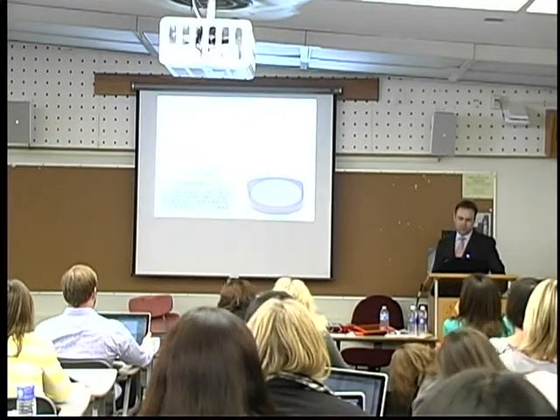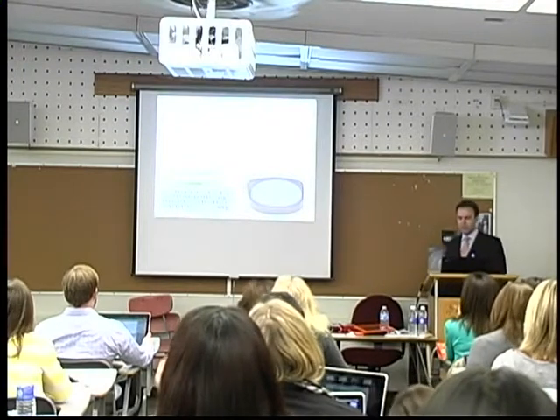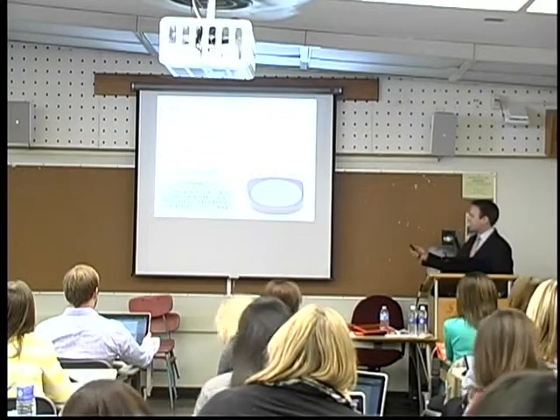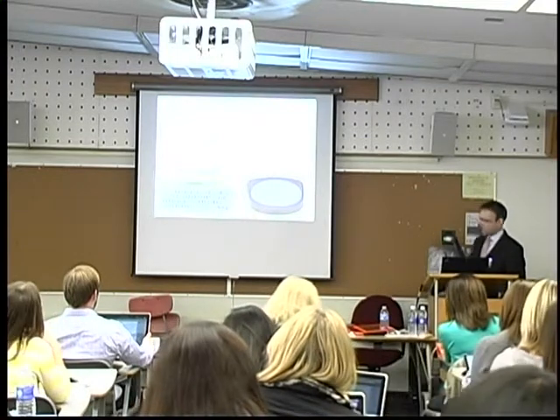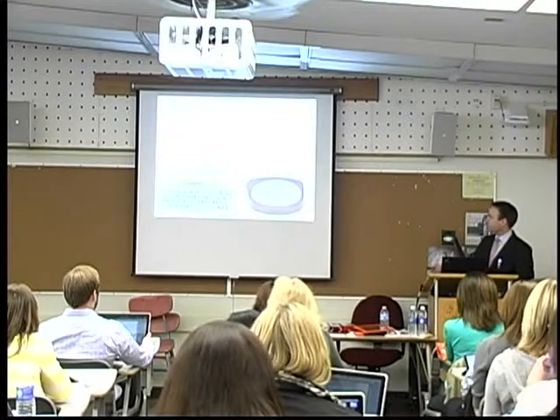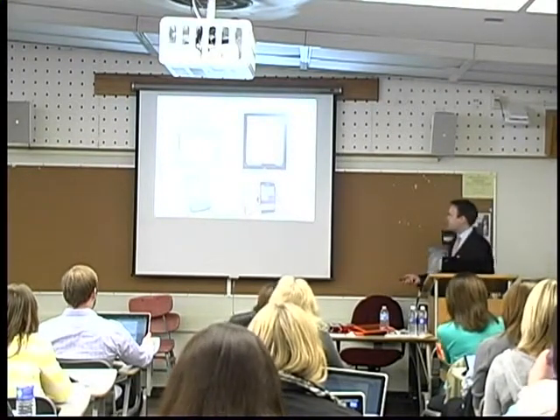Typically, graphic symbols are used to represent messages, and they can be activated by a finger, by a switch, a head stick, or selecting a symbol from the display. Here are a couple popular options: the Light Writer, which we have seen before in the video clip, or the Big Mac switch to record a message that is then played back by activation of that button. SGDs can come in many other ways.